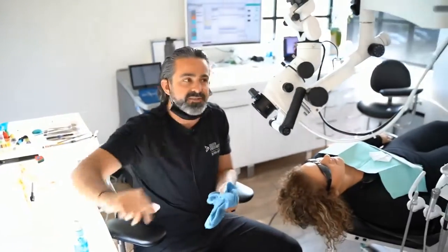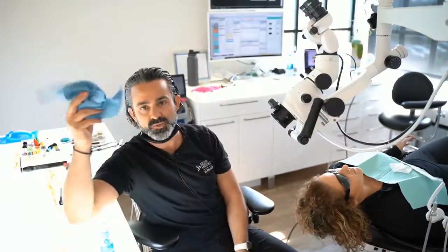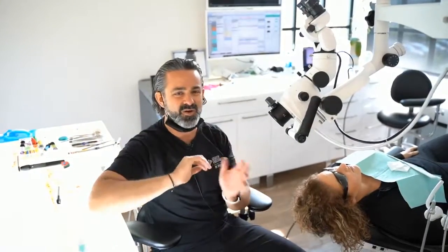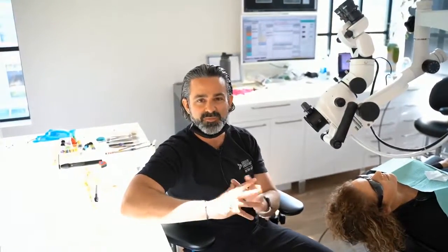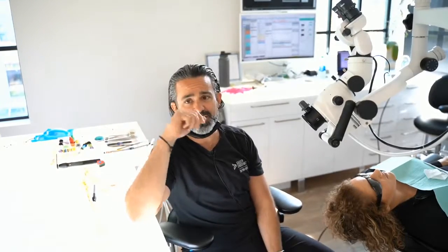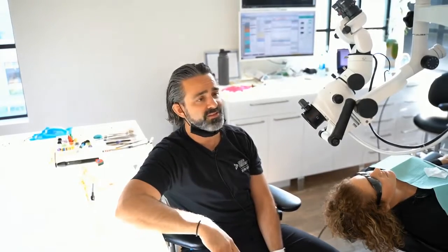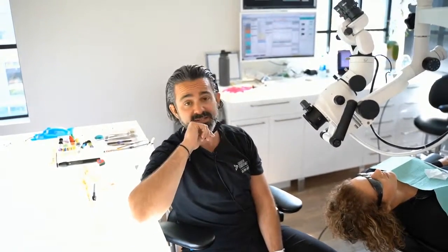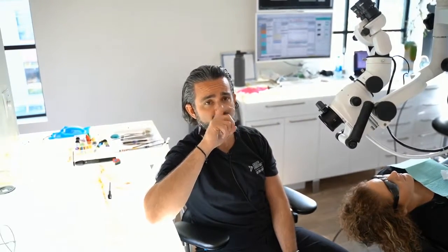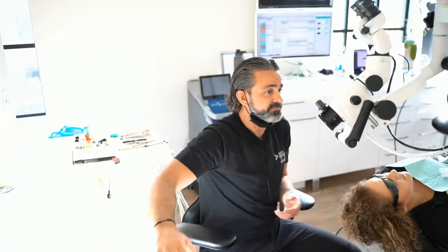So you do have to clean the lenses. Like I said, you can use what the company sends you for disposable caps, or you can wash microfiber towels. But to get in and out, especially in a general dentist office, where you see a lot more patients a day than I do, in that kind of high volume turnover, I would use the Kimtech cleaners. You clean test tubes and everything else with them, and they work fantastic. Kimtech also makes a lens cleaner with their cloth. So, great question.